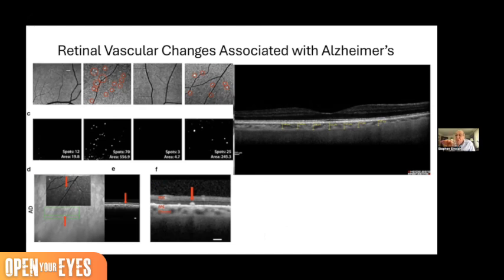Well, again, this is a new imaging methodology that potentially can visualize these plaques. And yes, they are associated with the focal aspects, but I think this is going to require a lot more differentiation rather than trying to group and look at percentages. We're trying to differentiate these different causes of Alzheimer's. I think that's where we're going to go.